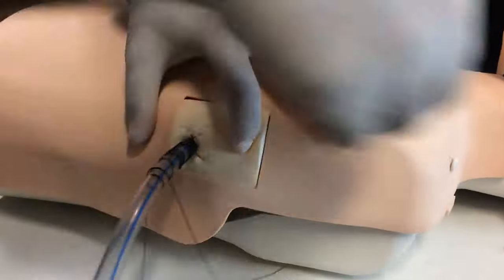So that is not going to come out. And so that is now secured using one stitch.